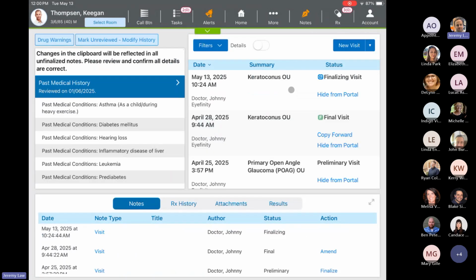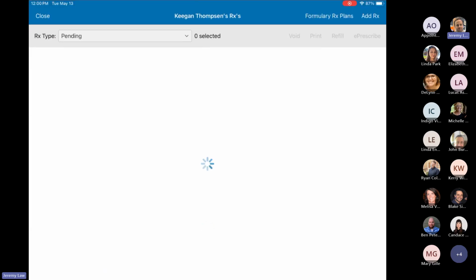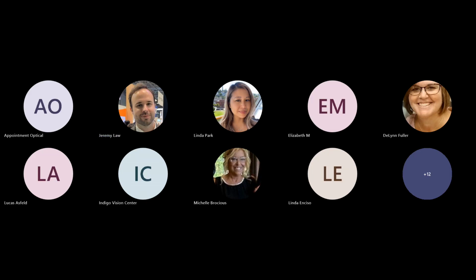All right, so we've covered the web application, we've covered the iPad app, we talked a little bit about the drawing tools just now. I'm going to, at this point, stop sharing my iPad, and of course come back to it if anybody has any questions. But I'm going to go ahead and bring back our lovely, beautiful slides here.